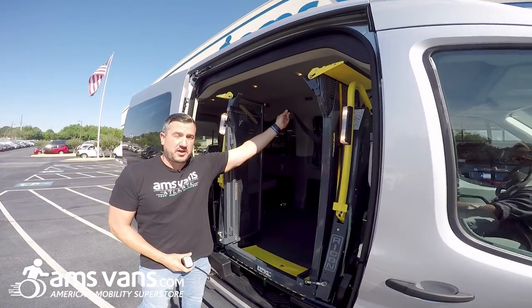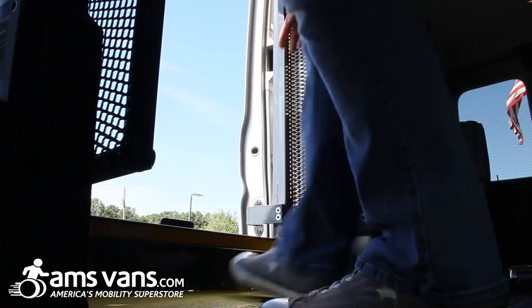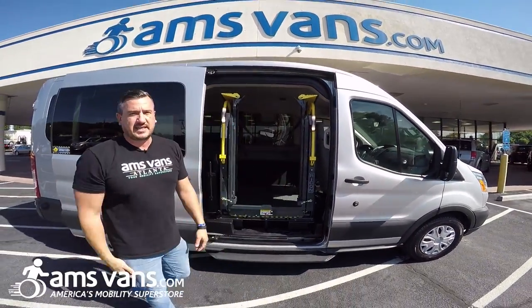You do have to watch out for your interlock strap. We cut into the step well right here for easier access for your foot. Come back through — you do have a handle here, grab on the door, step, come out — easy access.